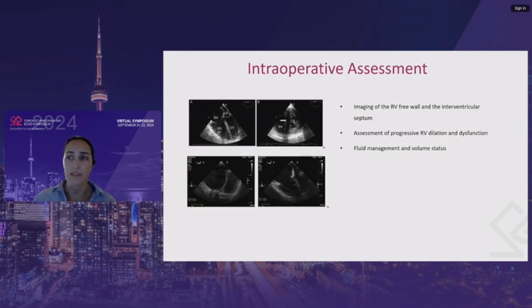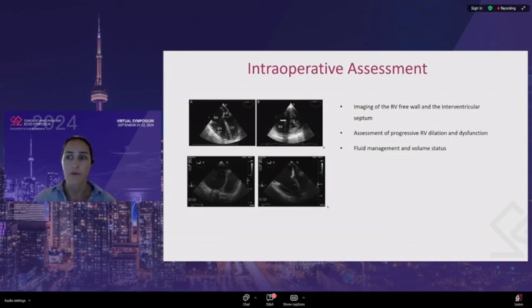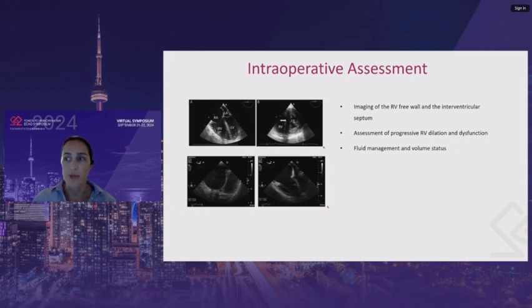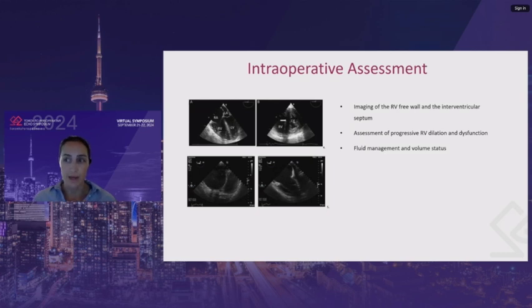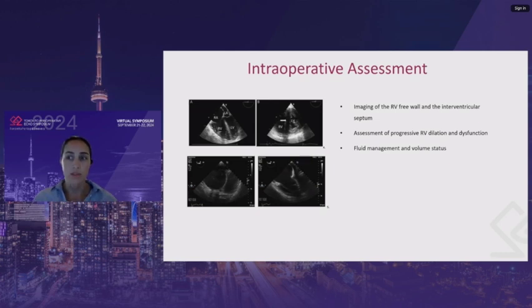If there is a pre-existing PFO or ASD with left-to-right flow, the cross clamp can cause a reversal of that shunt, causing worsening hypoxemia. TEE should be used to evaluate the interatrial septum and worsening tricuspid regurgitation. Once the clamp on the pulmonary vein and left atrium has been released, you will see some micro-bubbles in the left atrium and left ventricle, which can cause some regional wall motion abnormalities — these should be temporary. Ongoing bubbles are concerning for an air embolism on the left side of the heart and should prompt inspection of the bronchial anastomosis for a leak.